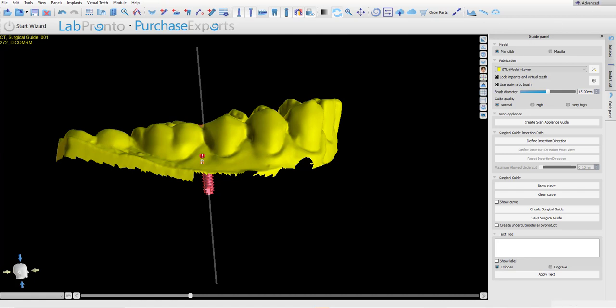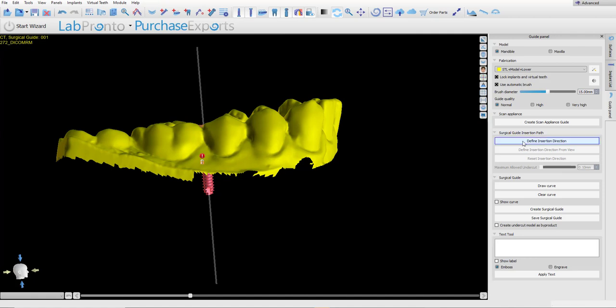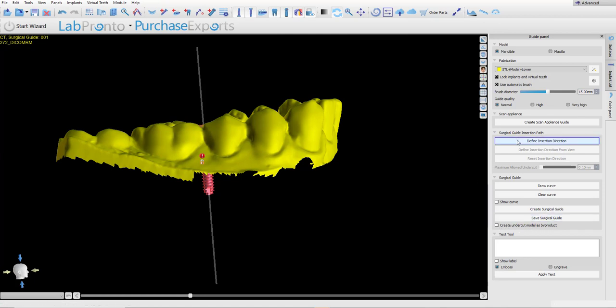In advanced mode, we could see we're in advanced mode. The user has the ability to create a custom path of insertion. The user also has the ability that if they want the software to create an undercut model, the user could check the checkbox. So for example, if the user would like to create a custom path of insertion, simply click Define insertion direction.